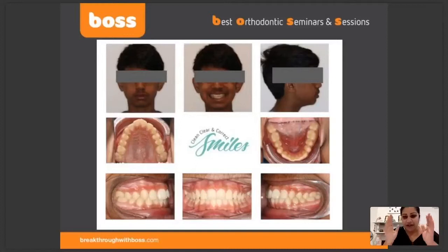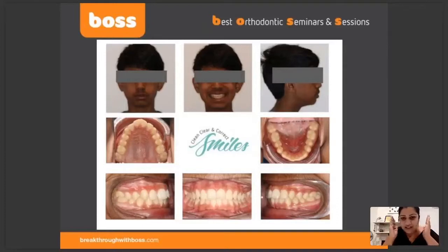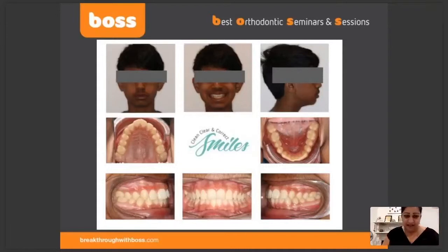Frontal smiling — that's a basic frontal smile. Now make sure if you look at these photographs, have a look at the extra oral photographs. Can you see the two ears? They're projecting equally. So we know we haven't taken a photo at an angle — it's actually projecting equally, so they're very symmetric photographs.